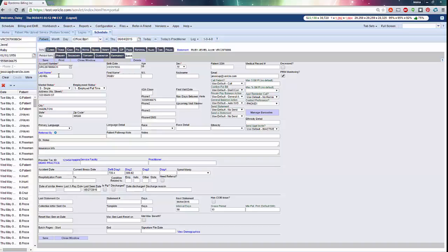For Posture Ray, the system will again match on the first name, last name, and date of birth and create a patient account if it can't find an exact match, unless the patient ID in Posture Ray is filled in. If the ID is filled in, it will try to match it with the account number on a patient account.